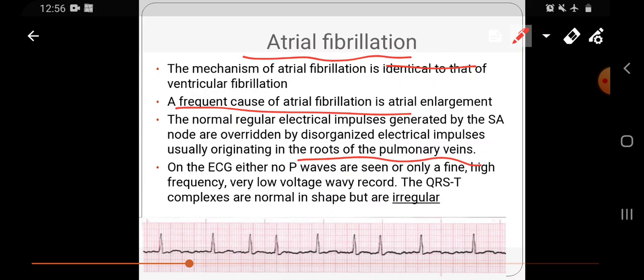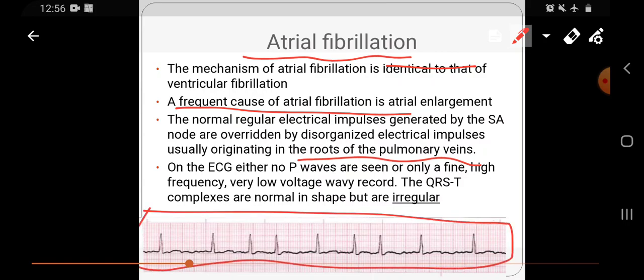هلا what we will see on the ECG strip هذا مهم. هلا اللي رح نشوفه إنه there are no definite P waves. ما في P waves لأنه ال P wave هي جاية من ال excitation of the atria، ويفترض إنه ال excitation لل right وال left atria it happens at almost at the same time ويعطينا ال P wave. فبما إنه ما في عنا coordinated excitation لل atria we will have no P waves. Simply إنه رح يكون ال baseline is wavy. Okay, ال baseline زي ما أنتم شايفين هون it is wavy, which means إنه في عنا continuous excitation بالاتريا، وهذا بيخلي اللاين اللي موجود بالاي سي جي ما يكون ايزو الكتريك.